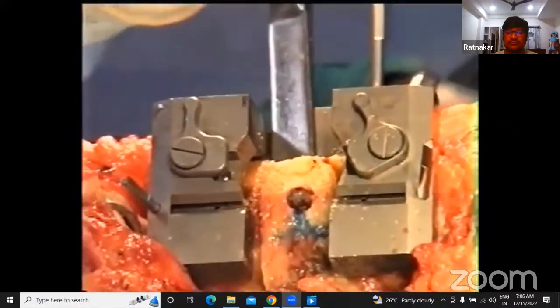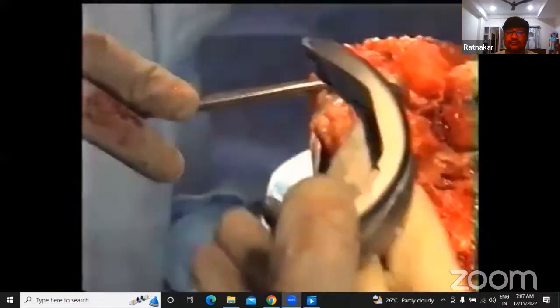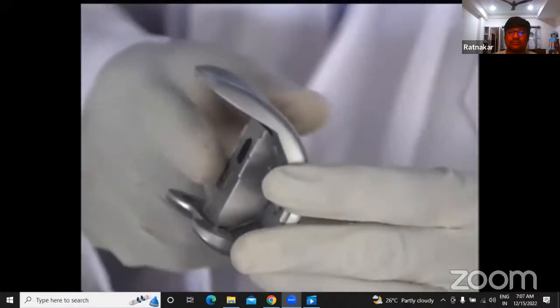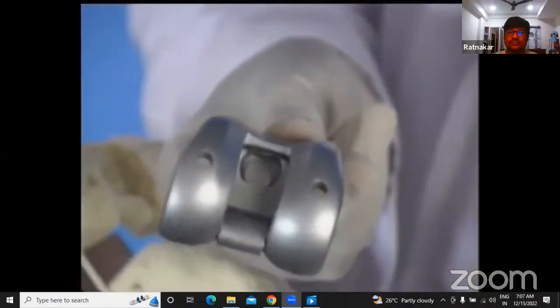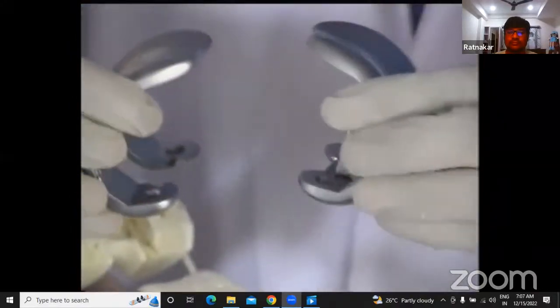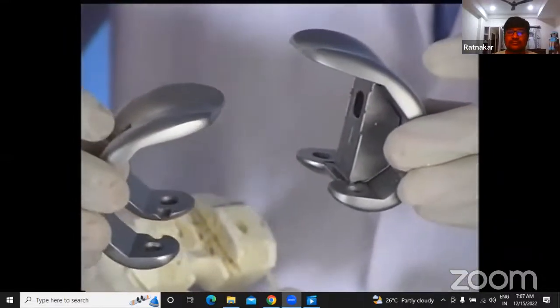When you do this osteotome, you have to go right up to the end and then only lift it up. Now that is the trial implant with the box, and that is the posterior stabilizing knee. In addition to the cruciate retaining, it has got a box. You can see that, and that is the profile of cruciate retaining and posterior stabilizing knees.